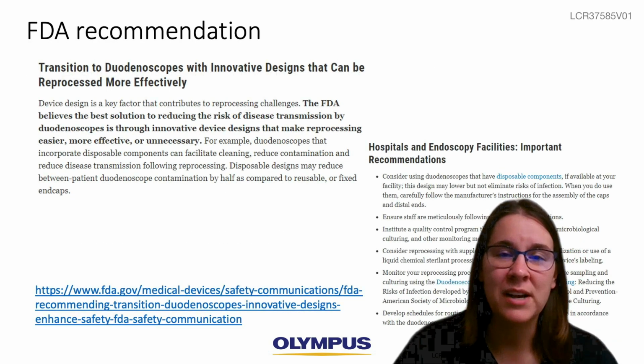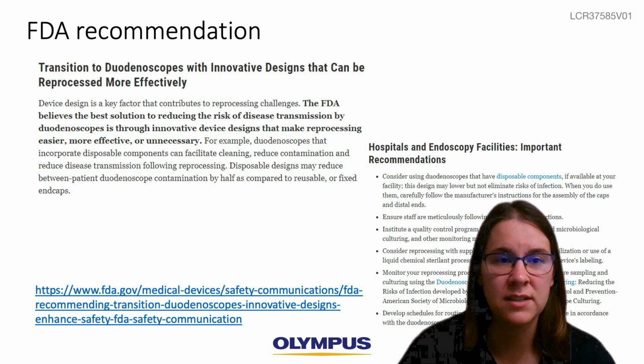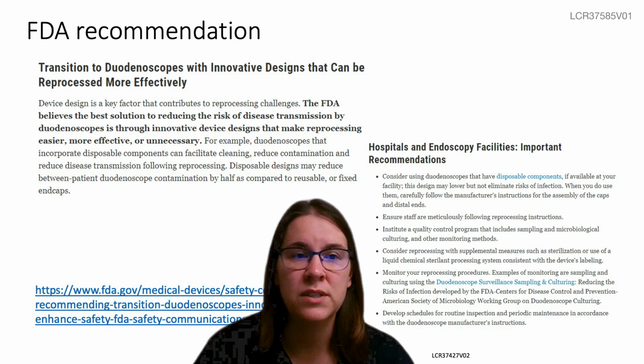Thanks for that deep dive into reprocessing chemicals, Jeff. Before moving into the new Olympus duodenoscope design, I'd like to give you an overview of the FDA recommendation on duodenoscopes. In August of 2019, following the 522 and human factors studies, the FDA made a recommendation for facilities to begin to transition away from duodenoscopes with fixed end caps to duodenoscopes with innovative designs that can be reprocessed more effectively. This recommendation includes duodenoscopes with disposable components, such as removable end caps, and disposable scopes.